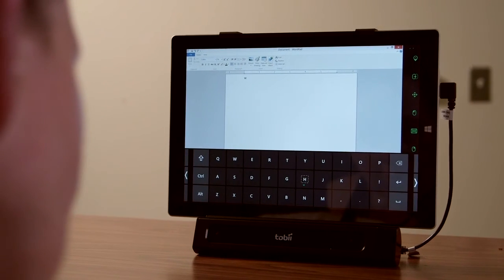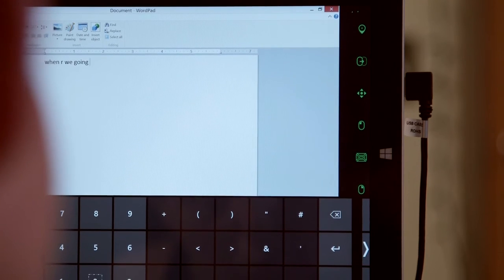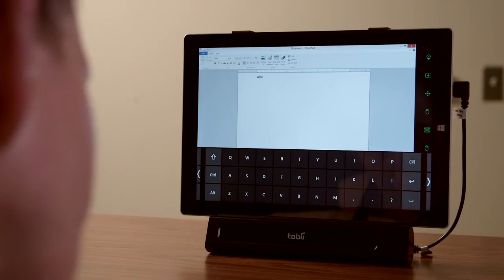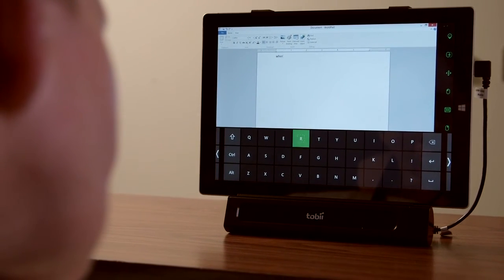All of our residents go through an assessment and training period so that they learn to use these adapted technologies based on what their physical abilities are. Using eye gaze technology, which means you're able to just use your eyes to control everything that you do on a computer, from internet access to email access to social media to game playing. That's one of our newer technologies.